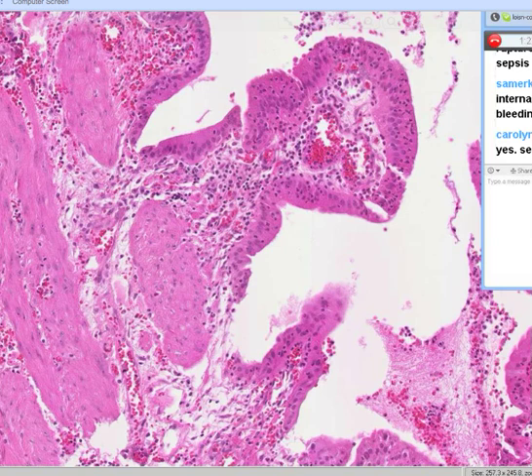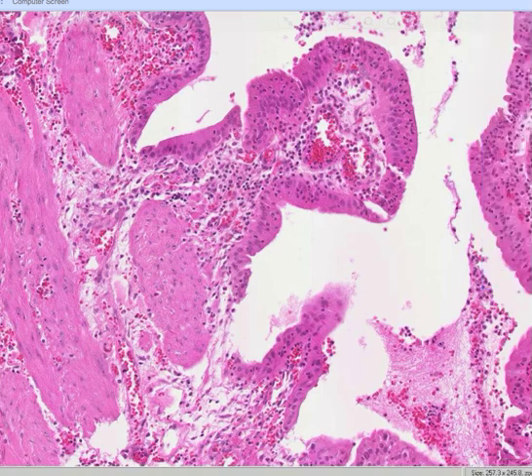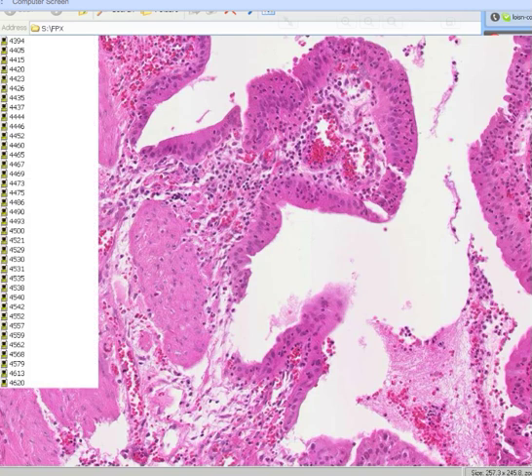And because I call this acute cholecystitis, if we go to where these inflammatory cells are in a higher power, we would see that they are lobulated. They are neutrophils. Oh yeah, you'll probably see some lymphocytes as well. But following the classical principles of acute and chronic, neutrophils in any organ, primarily neutrophilic infiltrates, means acute inflammation of that organ. Added to the fact that the blood vessels are tremendous. Yeah, neutrophils are the big key. Okay, we're done with acute cholecystitis.